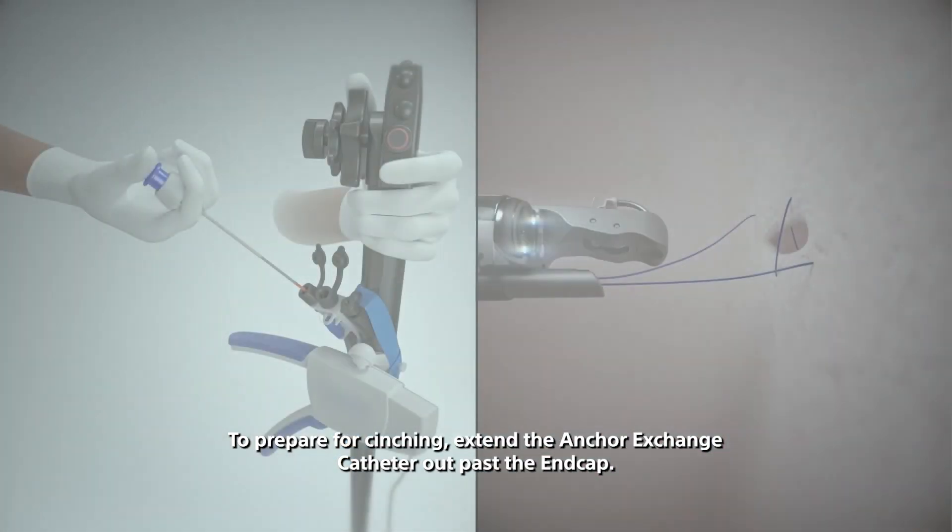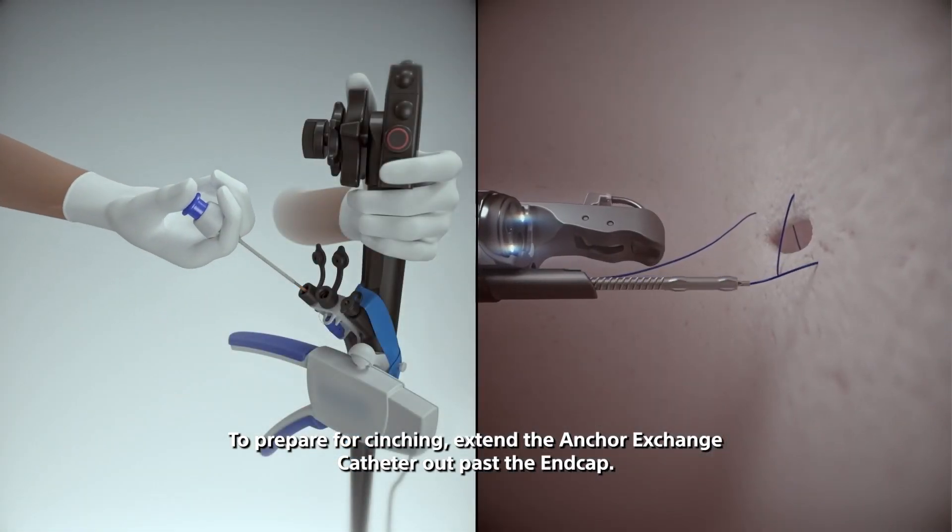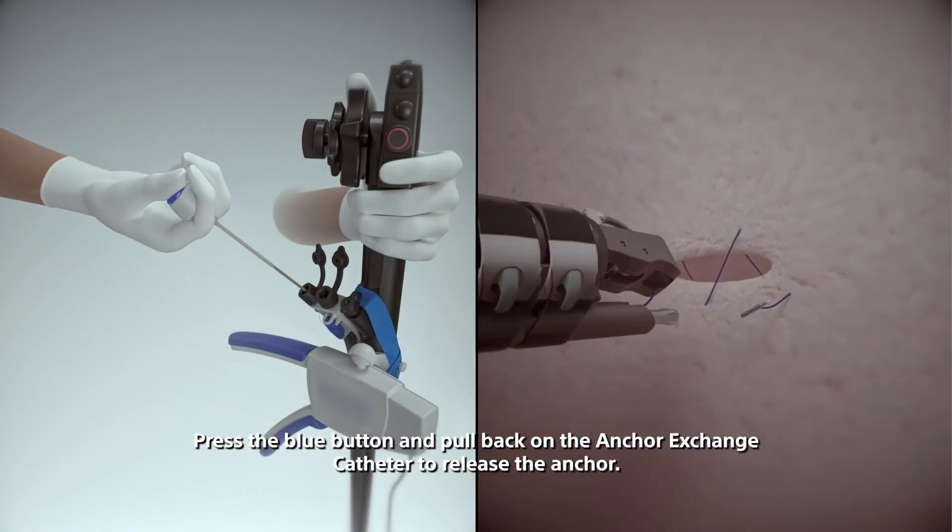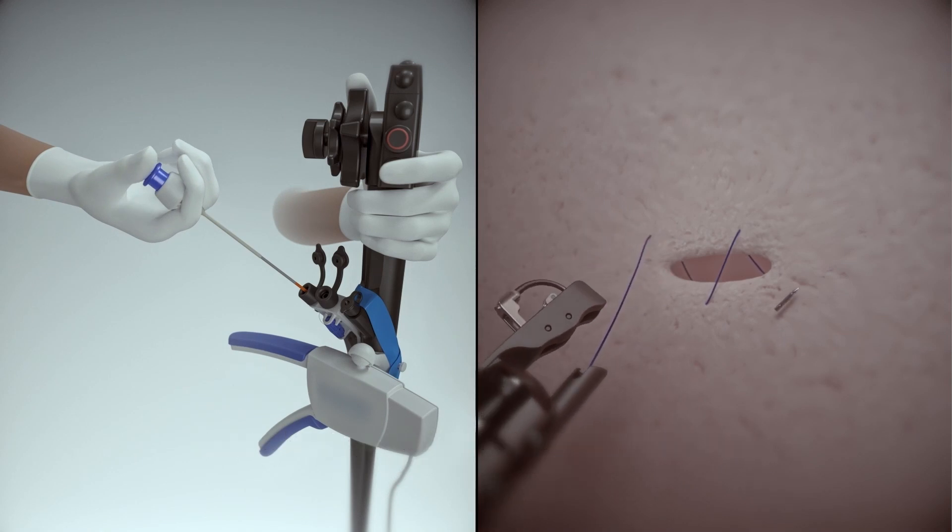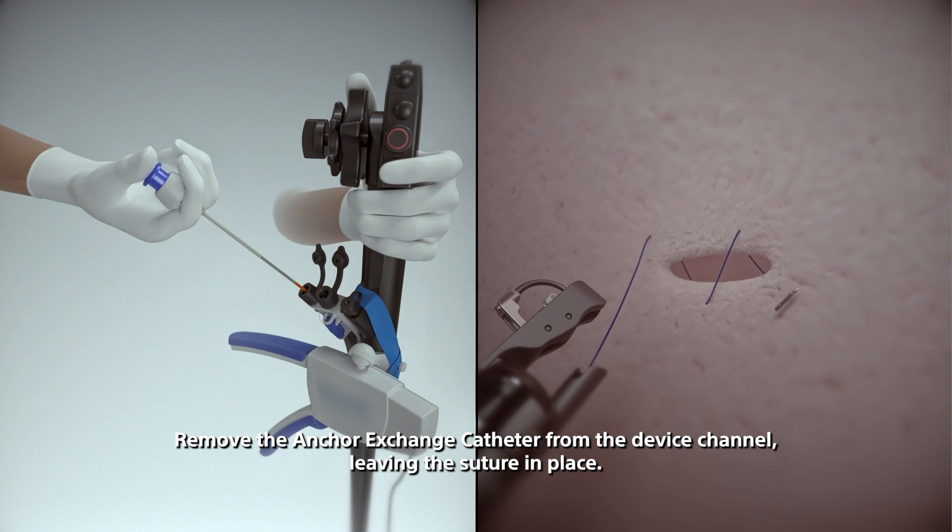To prepare for cinching, extend the anchor exchange catheter out past the end cap. Press the blue button and pull back on the anchor exchange catheter to release the anchor. Remove the anchor exchange catheter from the device channel leaving the suture in place.